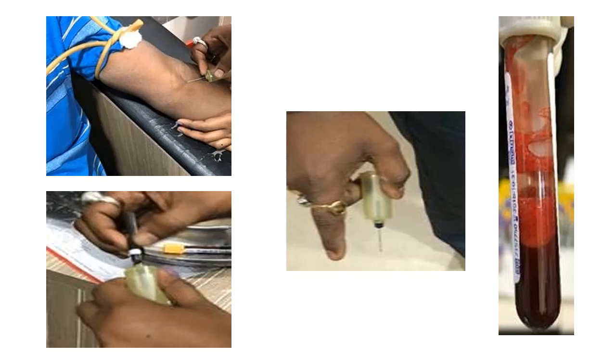The tourniquet has been used multiple times for multiple patients. Many a time we forget to decontaminate the tourniquet with alcohol after each collection. So what will happen, in case any patient has an infection, it may lead to cross contamination from one patient to another.